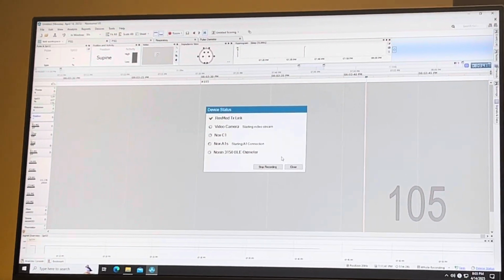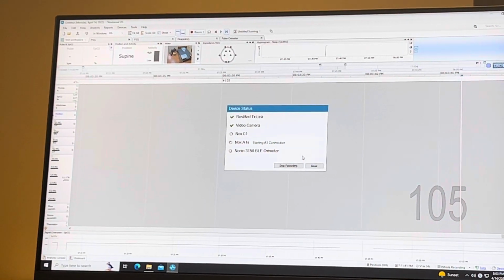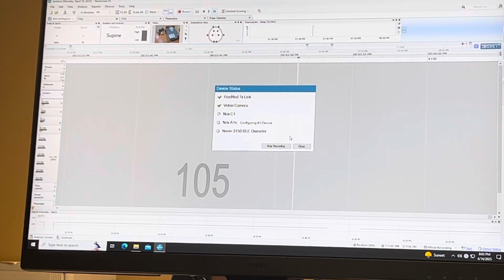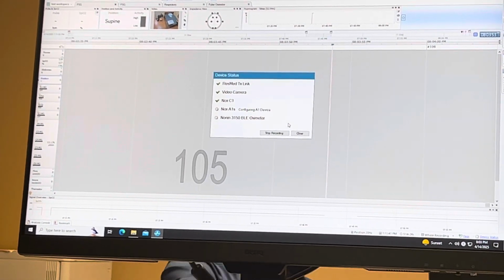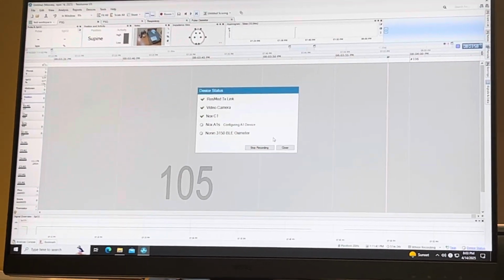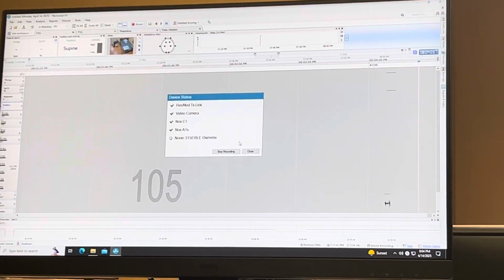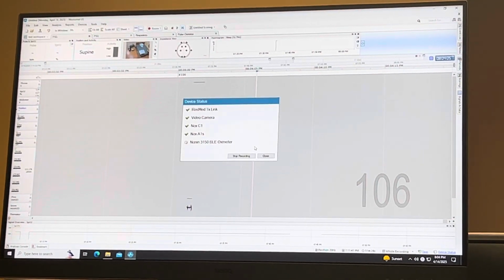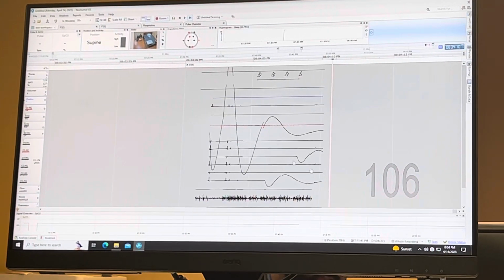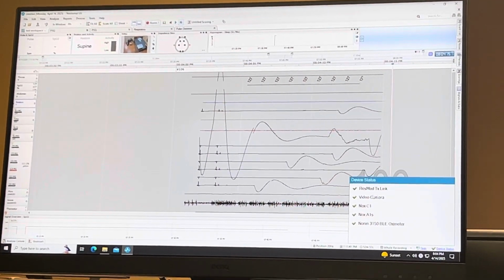This is when you can get up, go into the room, put the mask on the patient. If they wanna go to the bathroom, they can do that. And by the time all this connects, you can come back and not have to sit here and wait for all this to happen. Oh, I usually do that after I split, go in the room, then put the mask and everything on, and then I come back. Yeah, that's fine. You wanna kinda adjust your timing, because sometimes this will take a little longer to connect. And so right now, everything connected, now we look back at our device status, and now we've got our TX link here as well.